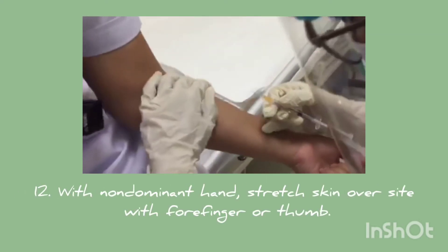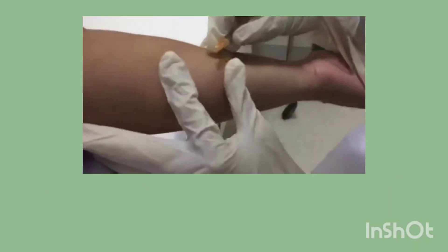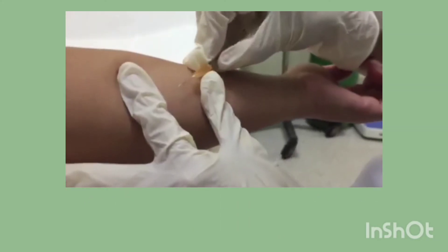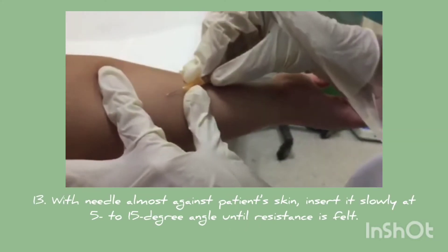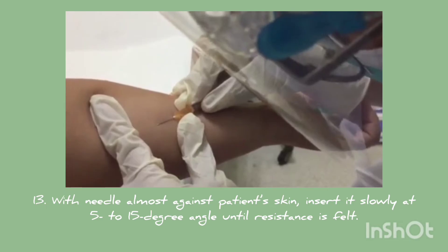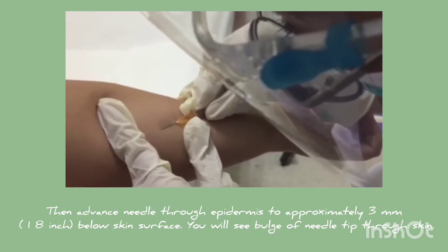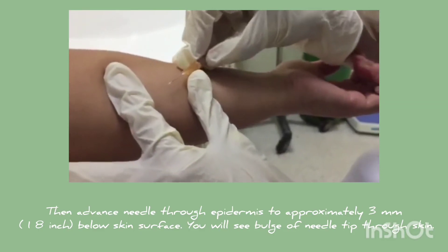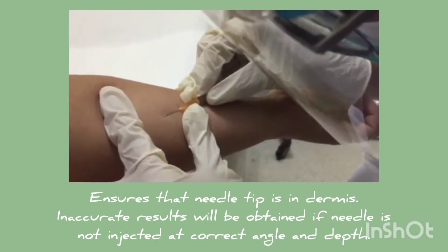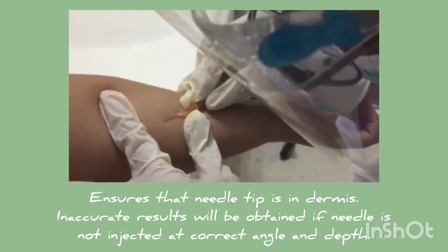Step twelve, with the non-dominant hand, stretch the skin over the site with the forefinger or thumb. The needle pierces tight skin more easily. Step thirteen, with the needle almost against the patient's skin, insert it slowly at a five to fifteen degree angle until resistance is felt. Then advance the needle through the epidermis to approximately three mm below the skin surface. You will see the bulge of the needle tip through the skin. This ensures that the needle tip is in the dermis. Inaccurate results will be obtained if the needle is not injected at the correct angle and depth.